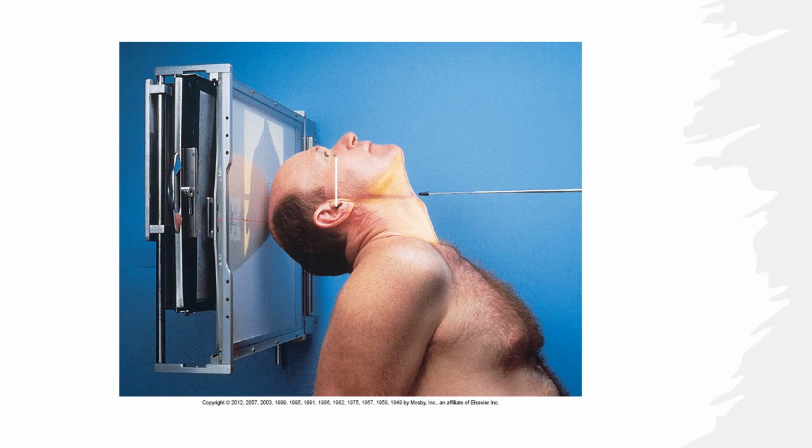Now what's going to happen is you're going to put about 10 degrees of angle on it, and then you're no longer going to be in detent, so raise your image receptor up so that you appropriately catch the newly modified axial SMV projection that you just made up on the spot, because your patient couldn't flip their head back far enough. It's very hard.